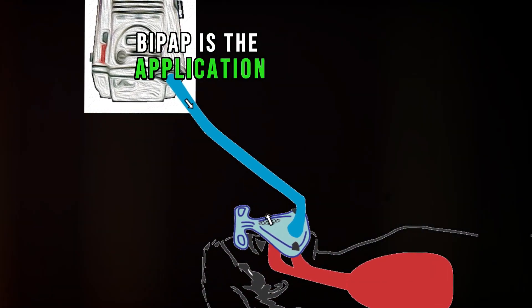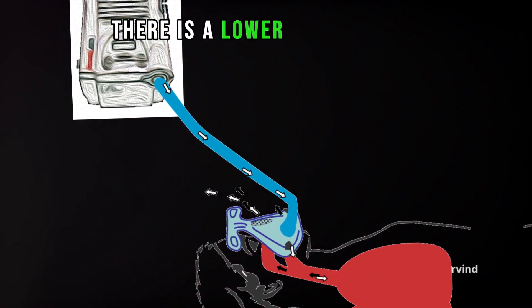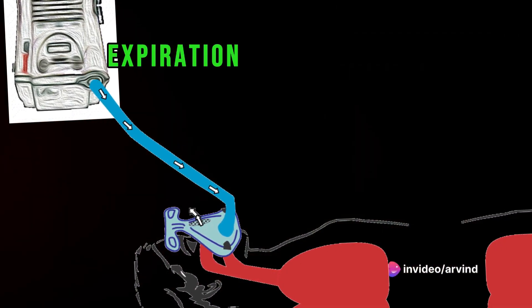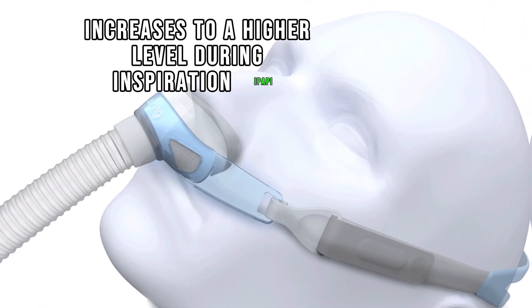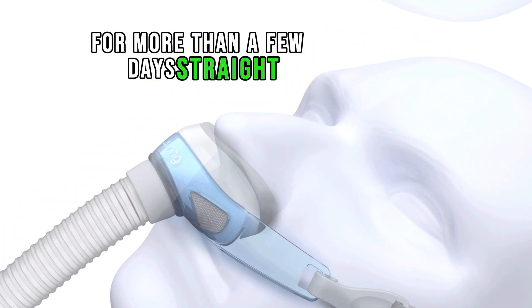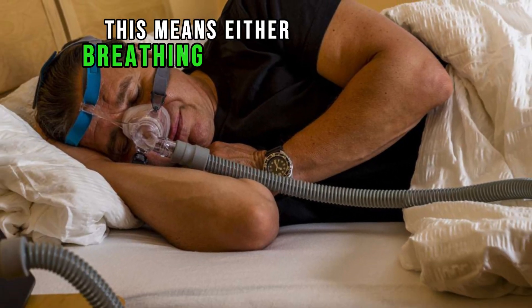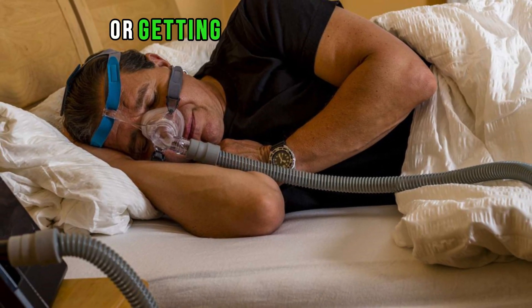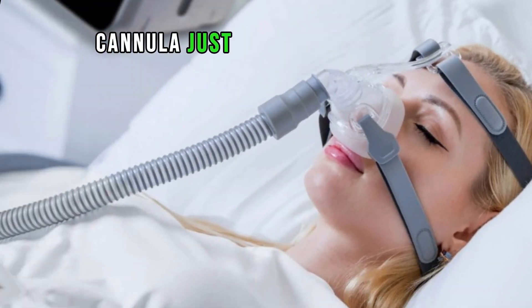BiPAP is the application of two different levels of pressure: a lower pressure during expiration, EPAP, and then the pressure increases to a higher level during inspiration, IPAP. If you need to be on BiPAP for more than a few days straight, you need to be able to take breaks — either breathing without a machine or getting extra oxygen through a small tube, or cannula, just under your nose.